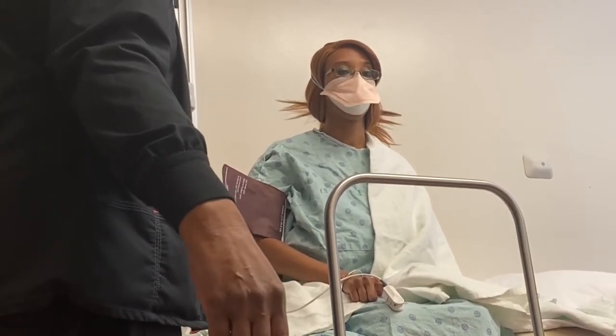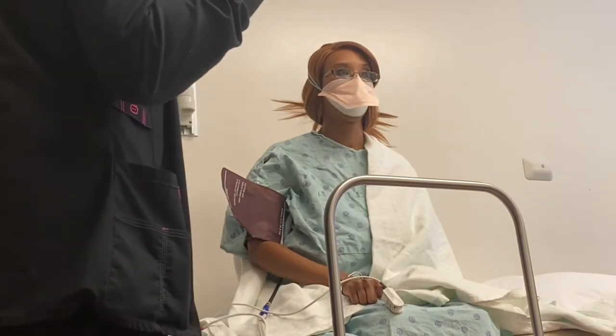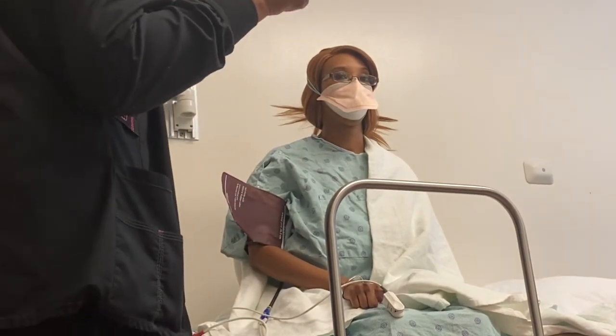You haven't had anything to eat since what time? Yesterday. Good deal. That's what we want. We want a good empty stomach. Can you take it? Go ask about it for a second. I'm going to get your temperature.